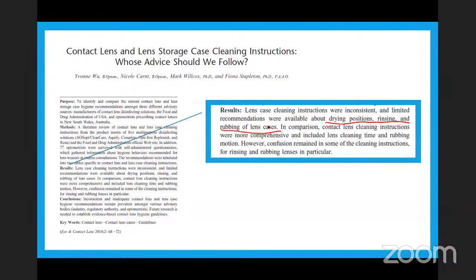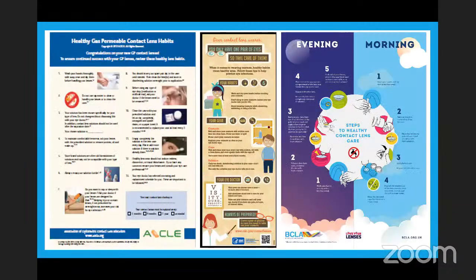So when you have this kind of problem, you can actually come up with your own recommended leaflets which you can give to your patients, so that they have these leaflets stuck up on the wall or on their dressing table, so that they are aware whether they have done all these steps or not. Washing hands, cleaning the lens, throwing off the solution, rinsing the lens, and all that. I have taken these leaflets from the BCLA and AOCLE website, but you as a practitioner can come up with some small, constructive, easy to read, easy to see instructions which you can give to all your contact lens wearers.